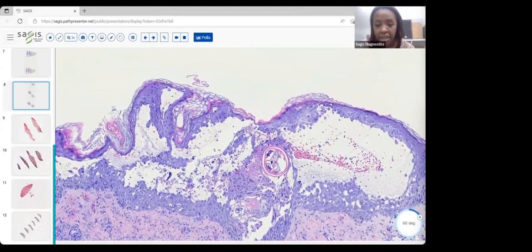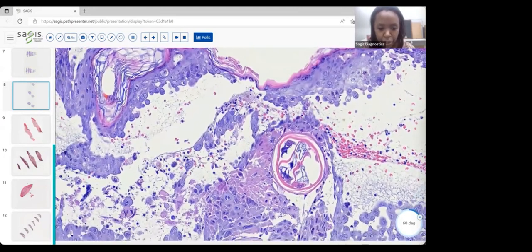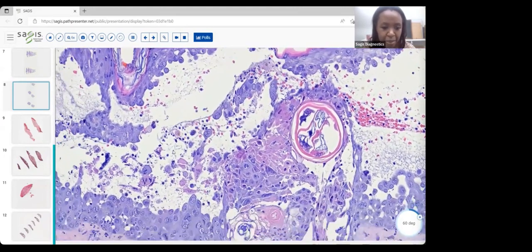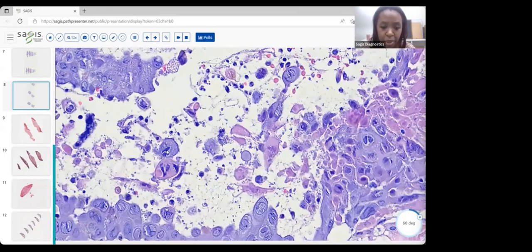And so looking at the keratinocytes, looking a little bit more at how they relate to each other, we appreciate that some of these cells are huge. These are keratinocytes. Some of them are just big, and they have these multiple nuclei. They're multinucleated. And really the way that we're getting these multinucleated cells is that the cellular membranes between them are breaking down.